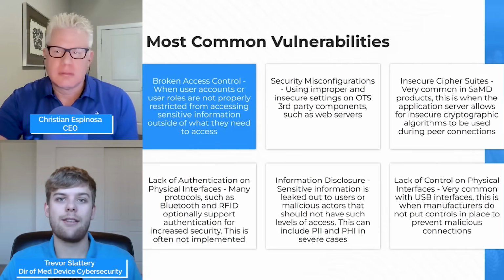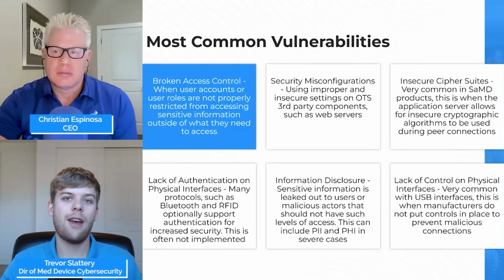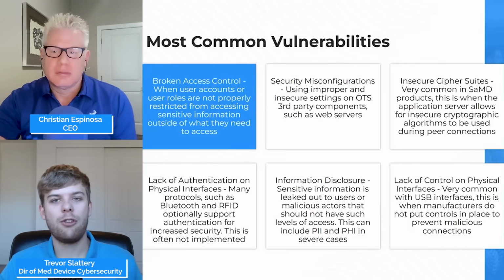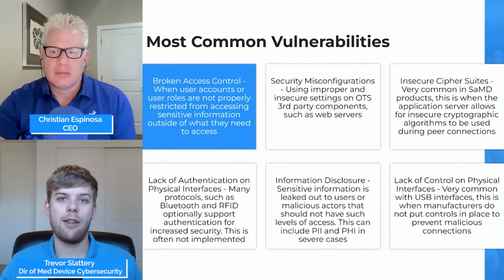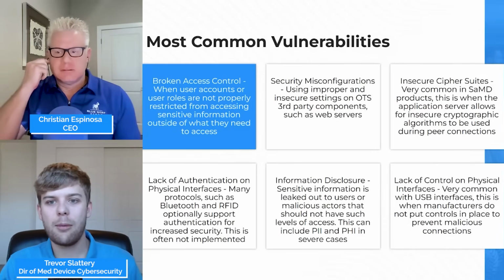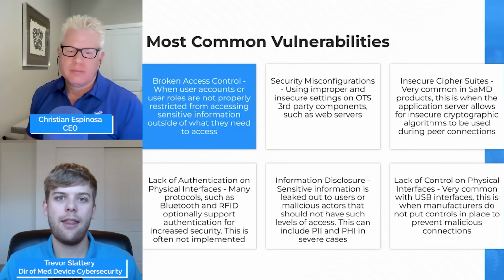Another common problem in software as a medical device is insecure cipher suites. What this means is when you're trying to connect to a website, there is a list of different encryption protocols and cryptographic algorithms that are allowed for that encrypted connection, since any information you're sending to and from that website should not be readable in plain text. Now, if the server allows for insecure or previously compromised algorithms to be used, this is a problem.